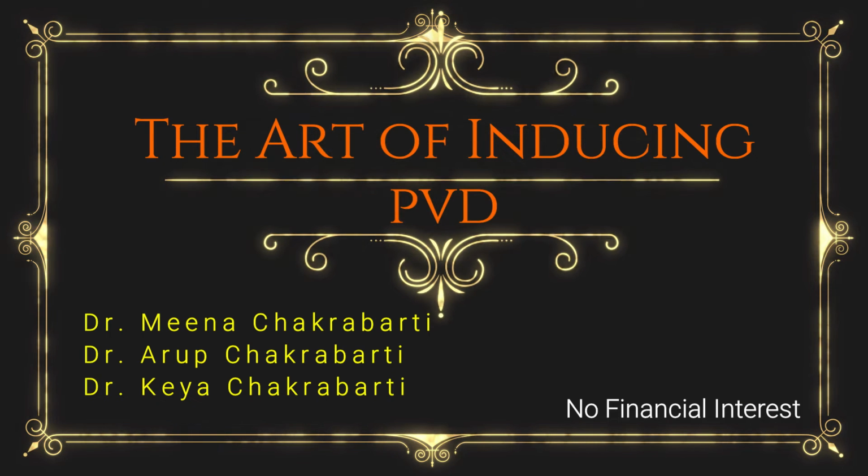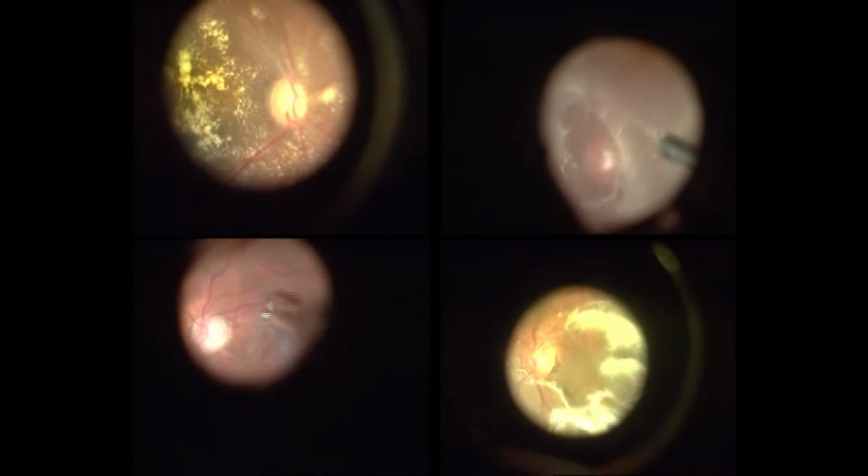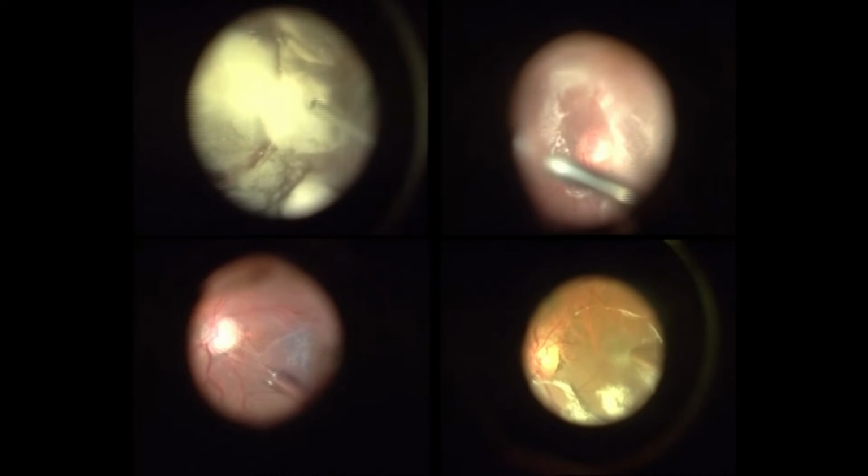Induction of posterior vitreous detachment is an important step in pars plana vitrectomy. Presence of a detached posterior hyaloid face ensures completeness of vitrectomy as well as the incidence of lesser postoperative complications such as recurrent retinal detachments, retinal tears, and development of epiretinal membranes.